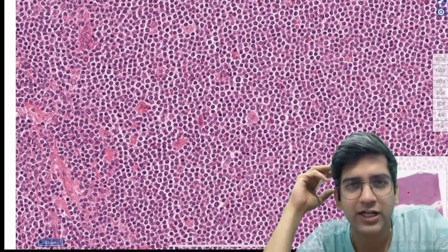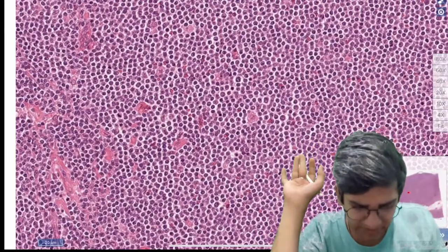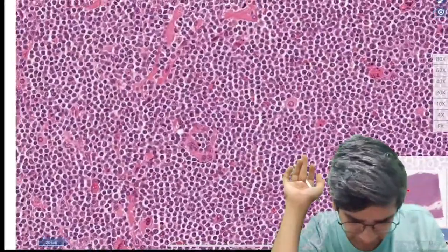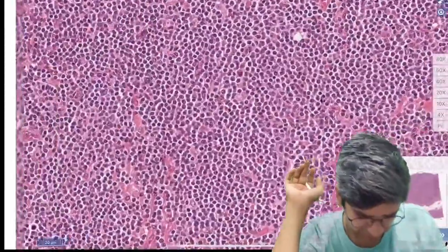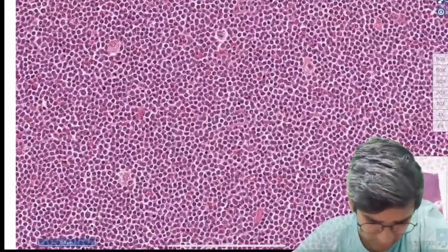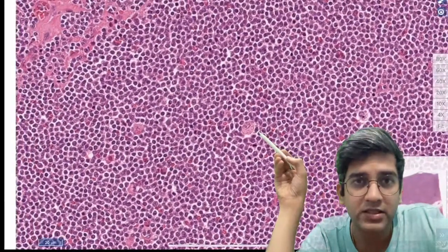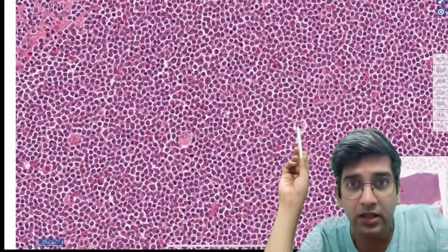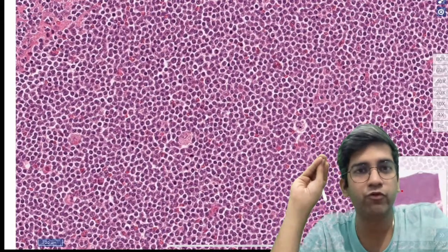Come on, it's fine. If you're wrong, it doesn't matter at all. Hakim, Junu, Vaishnavi, KD, perfect. Small? I guess you guys are convinced that it's small. Let's just go through and look at one more thing to see what's happening. If I have a very good histiocyte, let's look at some other area. That's a histiocyte in the center. Smaller? Definitely. I might have a tiny histiocyte here as well, right? Smaller, right? So you guys are comfortable in calling it a small lymphoid neoplasm, right?